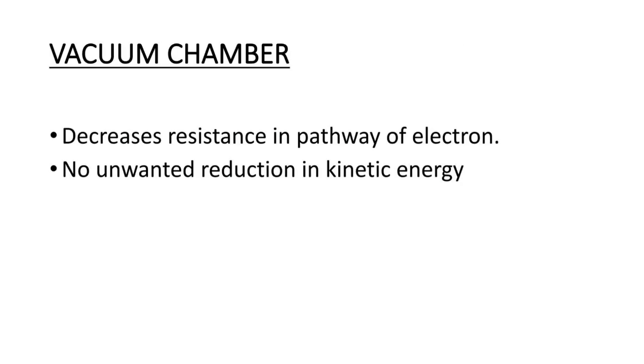Vacuum chamber is applied to decrease resistance in the pathway of accelerated electrons. As air contains many other elements like nitrogen, oxygen, carbon dioxide, these atoms will hinder the path of moving electrons.